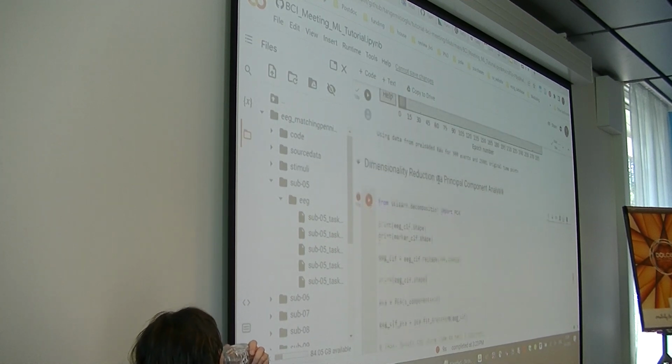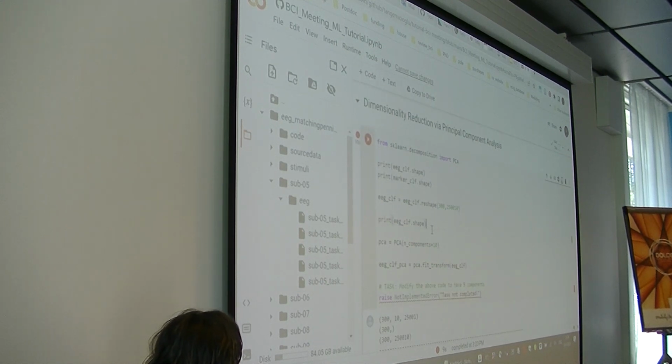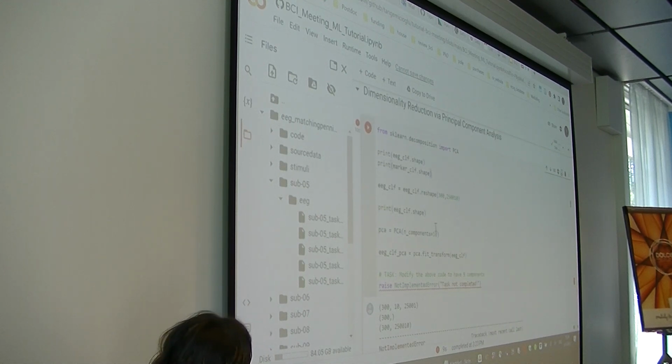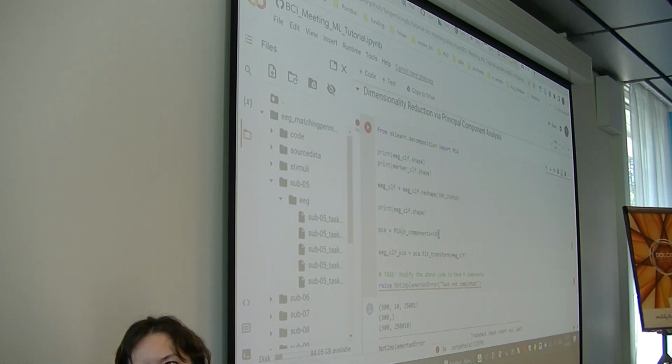So based on that, then we can apply our PCA, and that will reduce all of the data in each trial into something much smaller. And as Julia mentioned, you can look at how much each of these components is covering in the data based on the variance included by it, and you can also regenerate your data to look at how it looks by using the eigenvectors. Does it apply normalization by default? Sorry? Does it apply normalization by default? This one I don't think it does.